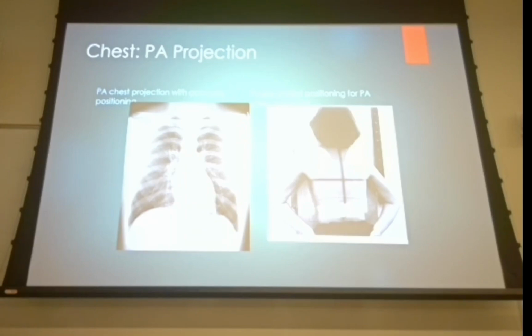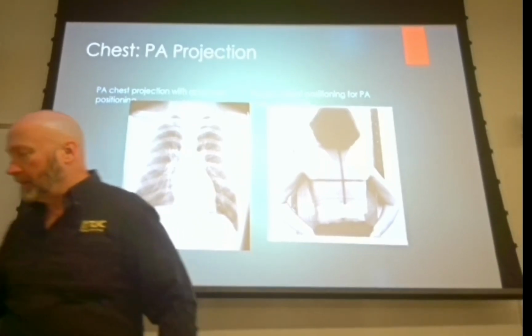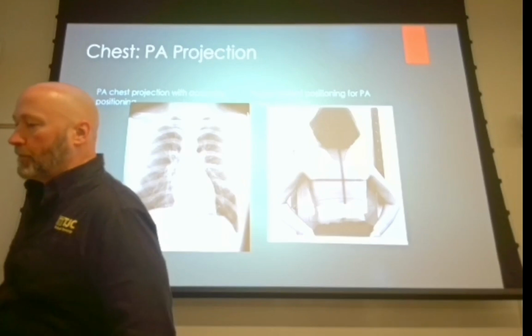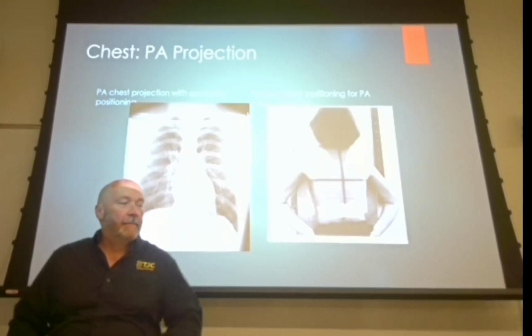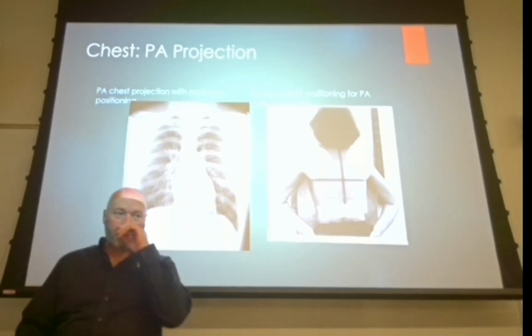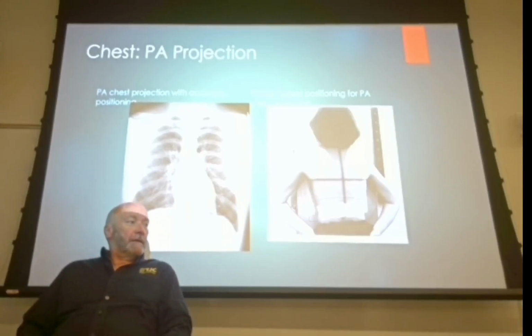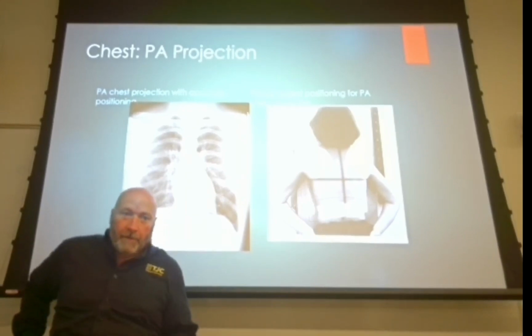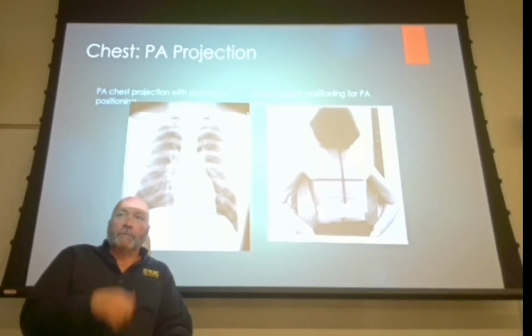If you're shooting a portable chest x-ray, some of these things we just have a tendency to overlook. So let's say you're shooting an AP either in the department or portable, and you've got the patient on a stretcher or in a bed, and most of the time you walk into the room and how's the patient situated in the bed? Leaning back. They're leaning back, right? They're comfortable. They might be hiked up on a hip, something like that, right? So they're comfortable. They're watching TV.